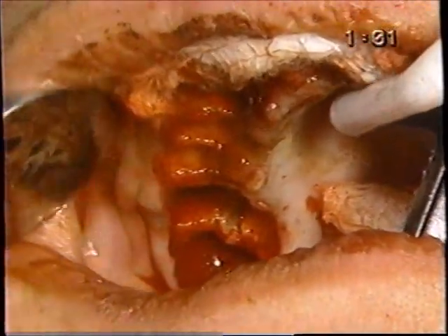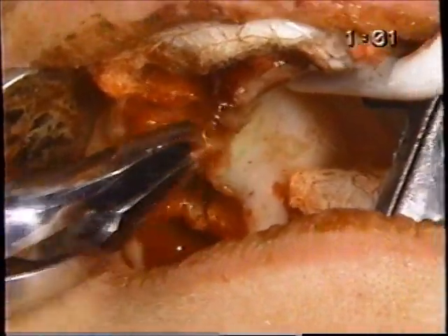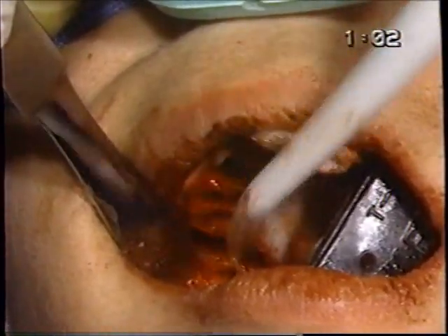First thing, rongeur for the papillae. Next, after that, it'll be rongeur for the sharp bone. These are for the papillae that did not come out with the teeth themselves. This one happens to be the R1 Hufredi, both end cutting and side cutting, a feature you definitely want. Very effective, even can help with soft tissue removal, but particularly smoothing bone.